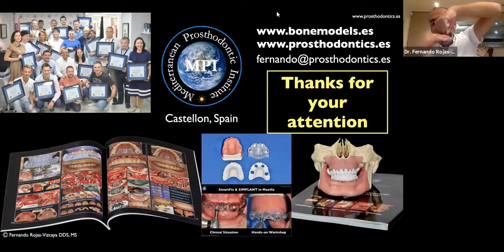below, the tissue is here. But after a few months, the tissue is like this. When you remove the prosthesis, you can see this shape. You are not doing compression. You have 3 millimeters below, and the patient can perfectly clean. This is another topic that I can speak 2 hours about.